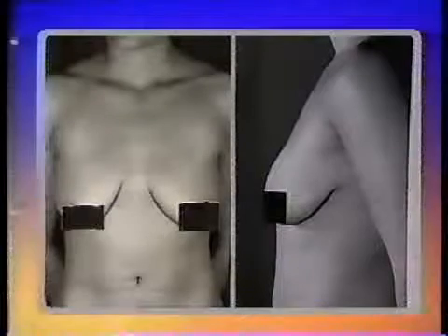We have some pictures now of breasts like Leslie's, right? This is not Leslie. It's an example of what happens after multiple births and also after weight loss, where there is a drooping of the breast as well as flattening. Many women who are older have this condition, and we can do a breast lift to bring the nipple up to the proper position and also give fullness by placing an implant.